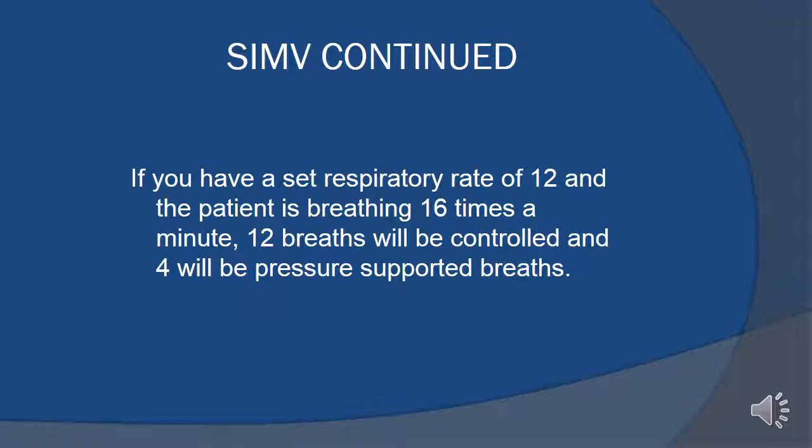Now, it's really cool, too. Remember, the key word in this is synchronized. So what the machine does, if you have a set respiratory rate of 12 breaths per minute, well, there's 60 seconds in a minute, that means every 5 seconds the machine knows it has to give a controlled breath. The machine synchronizes itself.